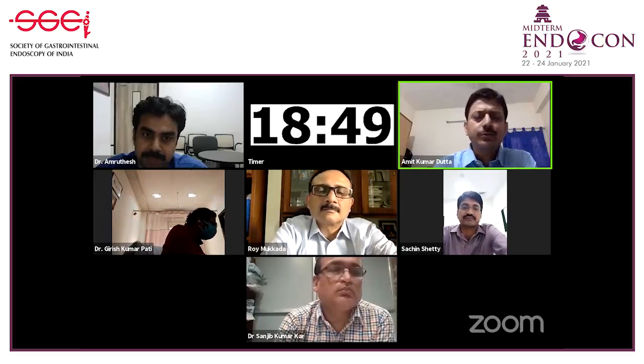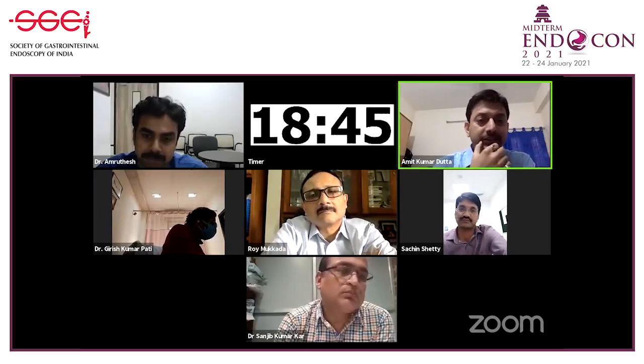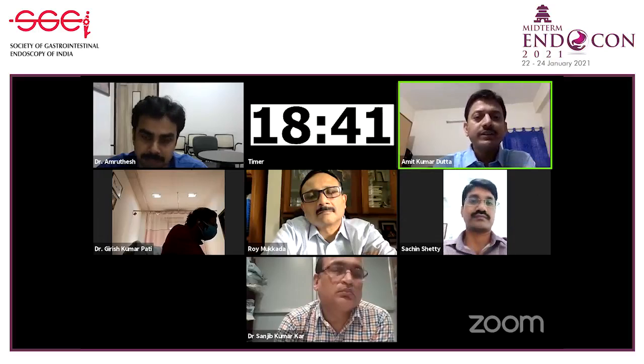see, optical, digital, there is a little bit of difference in terms of zoom part, but even the digital zoom which we have is giving you a good amount of magnification. Okay. Now, obviously, the older, the 180 series, was not very great, I must agree, but the newer, the 190 is quite good actually. And what you are interested in knowing is the morphology of the pit, like tubular or branched or not. And that I think is quite easy to make out both on the digital zoom as well as optical. I think the optical scores over digital in terms of the vascularity, which is slightly easier to appreciate in the optical system.